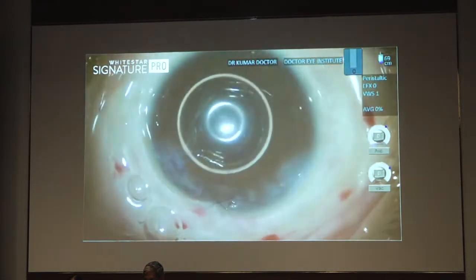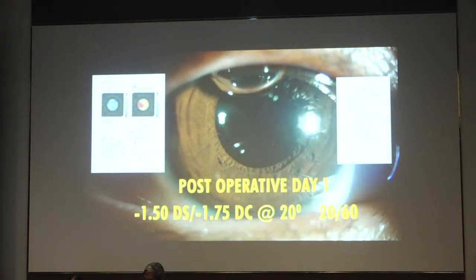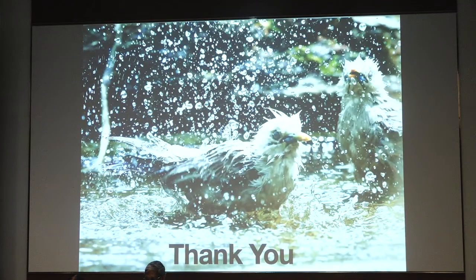Air placed. Post-operatively, overwhelmed to see the first day post-operative visual acuity of 20 by 60 and a refractive error of -1.5 spherical with a -1.75 cylinder at 20.